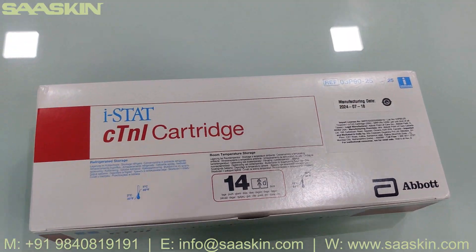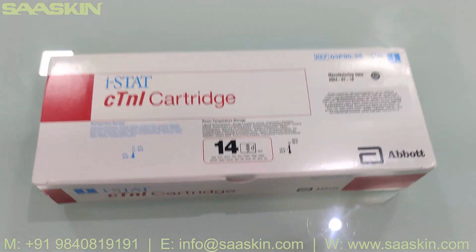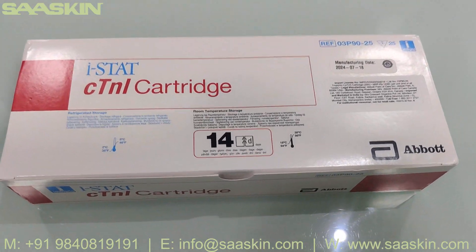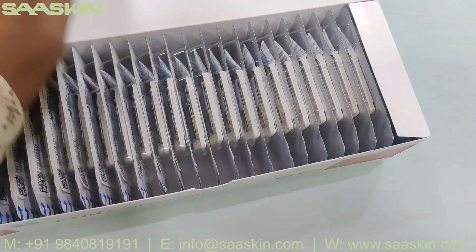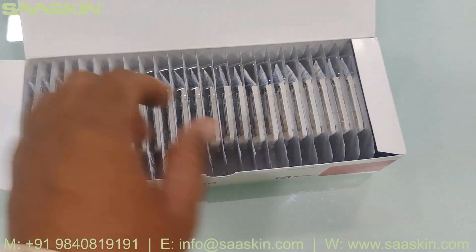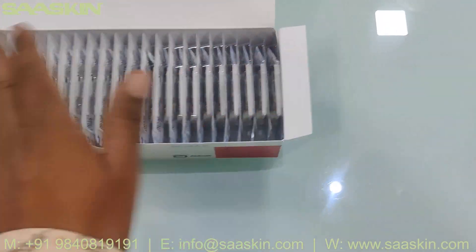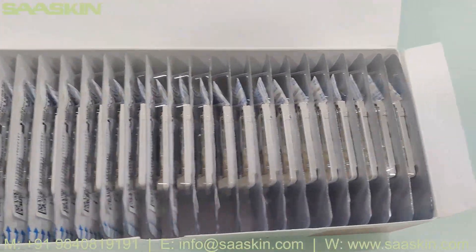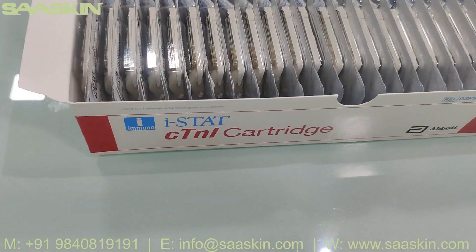So this is how it looks like. You can see the 25 test kits inside — each cartridge is nicely sealed and packed.